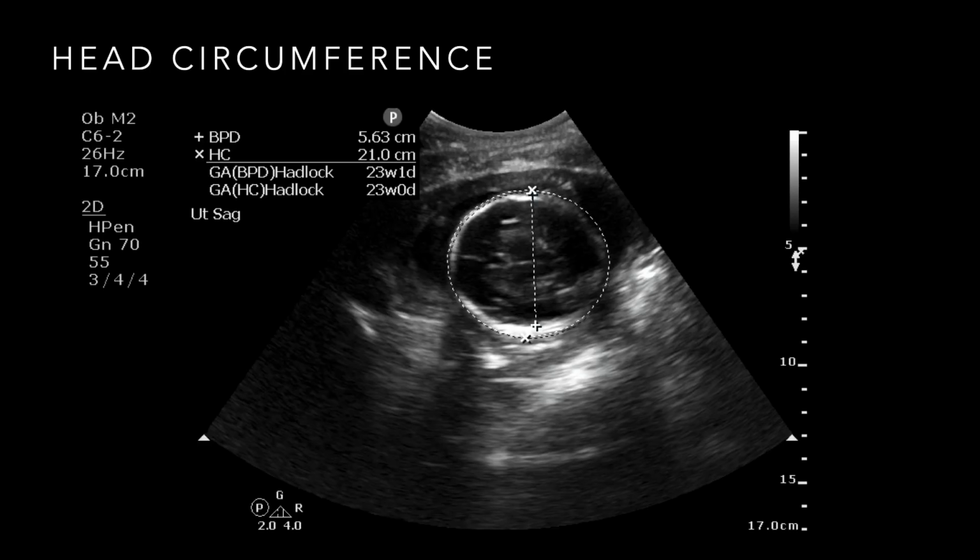And so the machine gives you a little oval that you can overlay on the head. You can adjust its width, you can adjust its length, and the roundness of it, and overlay that on, and it will calculate that perimeter, right? In this situation, it's about 21 centimeters, and again, it roughly correlates with that 22-week pregnancy that we saw in the last patient. And so this one's really helpful, right? This is another way of getting a gestational age assessment.